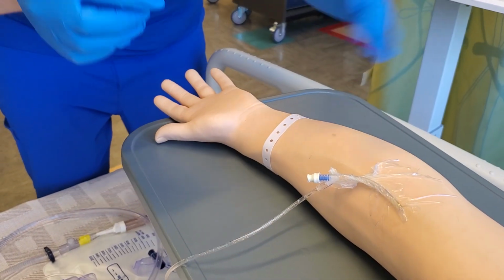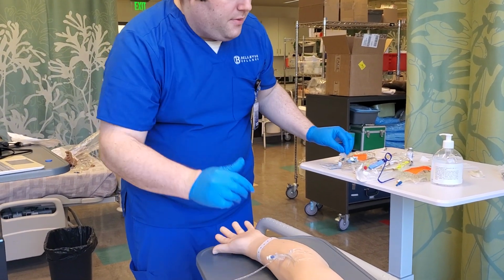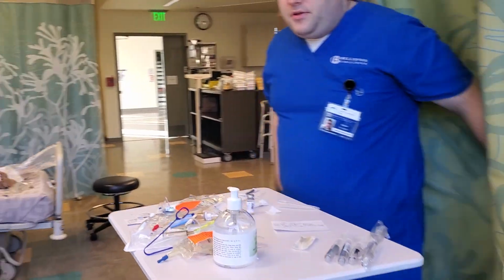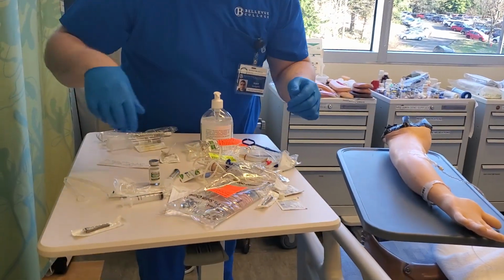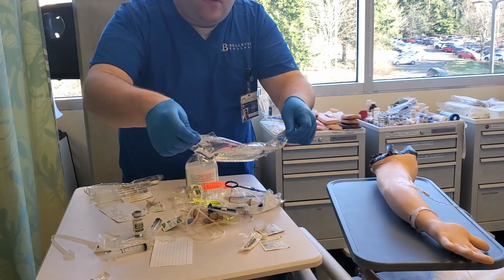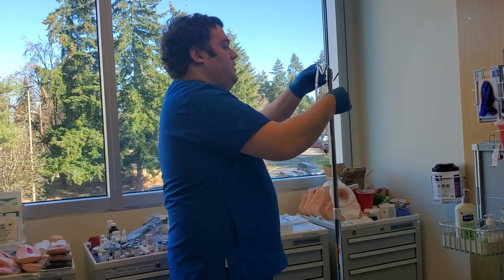Checking for any leaking, trace inflammation. Then we'll say that we've gone and scrubbed again, and then we will cap it. Next, we're going to go ahead and set up the IV. So we'll do a little. And so we have first, and what I forgot, hold on a second. Okay. So we'll go ahead and set this up here.